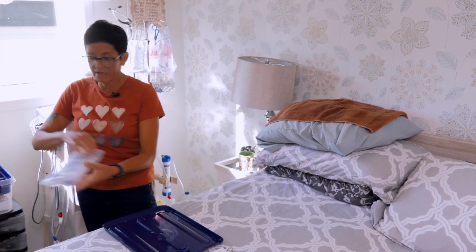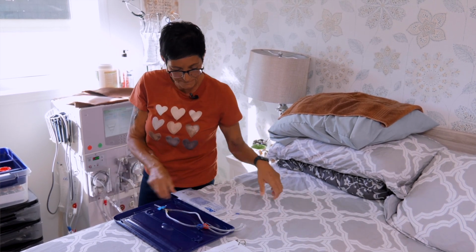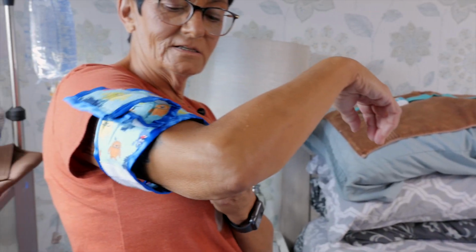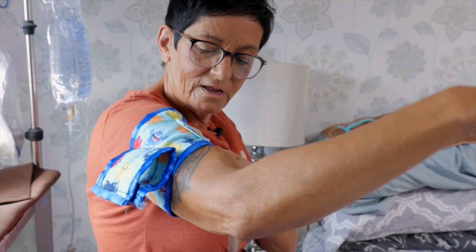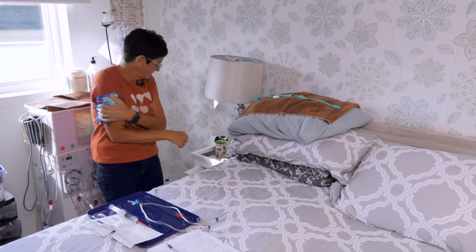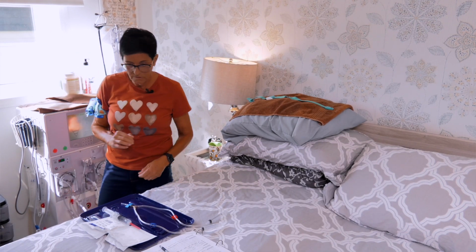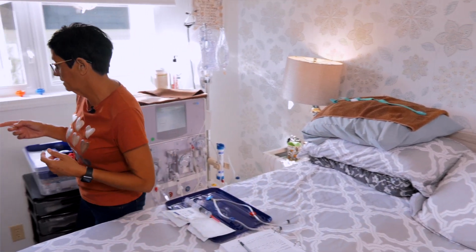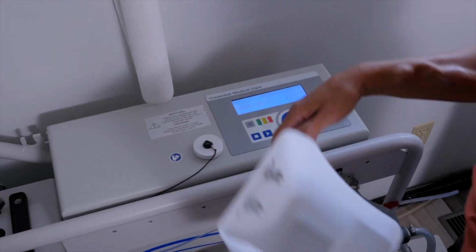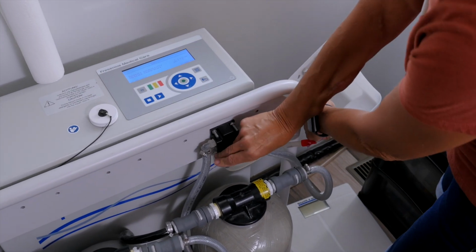Then I set up my needles. So this is what a single needle user looks like. Holds my lines while I sleep, so then they're not tossing and turning everywhere. I was given one when I started from the unit, and then I had to recreate because I wore it out. So it's been 10 minutes, then I'll have to test my RO water for hardness and to make sure there is no chlorine, and not too much chlorine in my water.